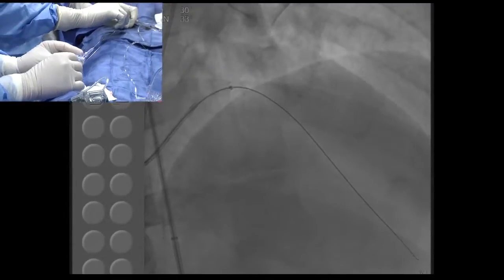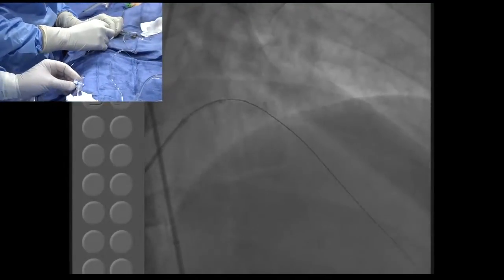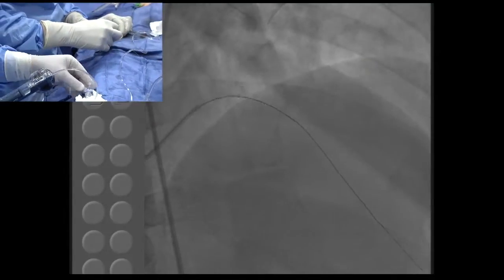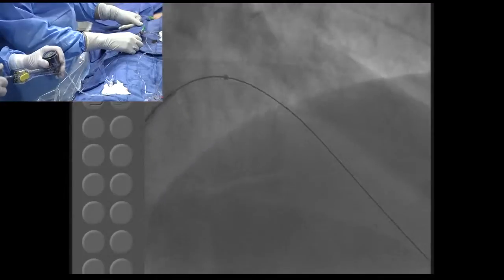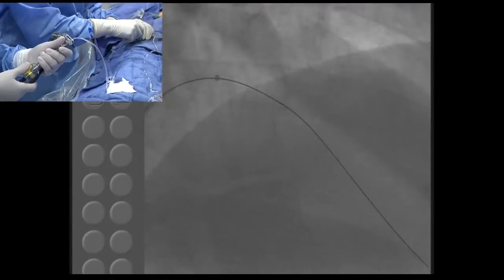And then after that, you can take a 2.0. We have the 2.5, no? Once we do this, the 2.5 will go. Okay, go up here. Okay. Let's magnify. You won't see this balloon anyway. 12 atmospheres. Yeah. I want to bring this back, okay? It's too much damage.